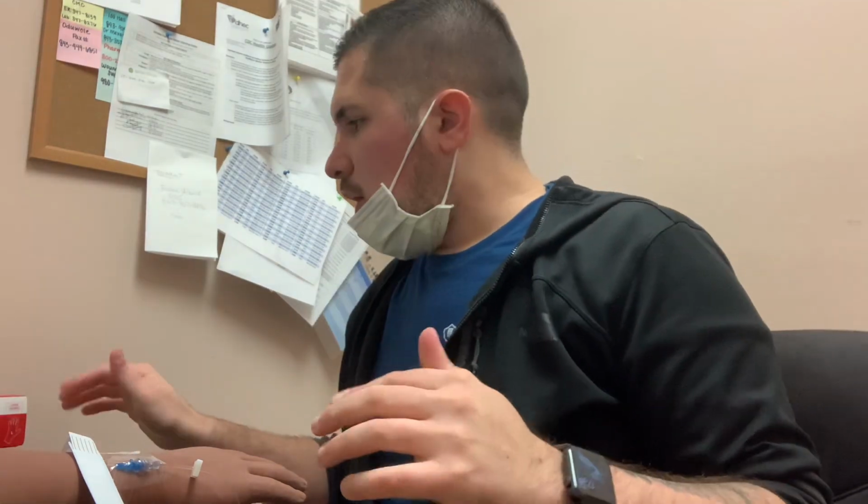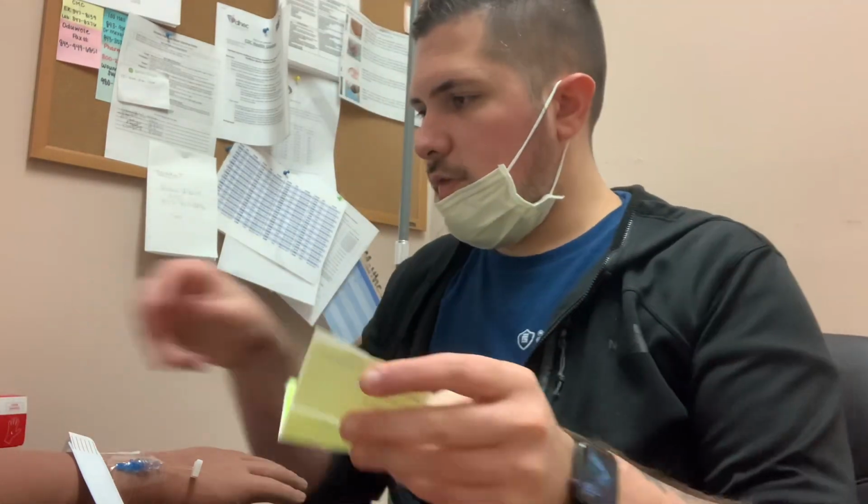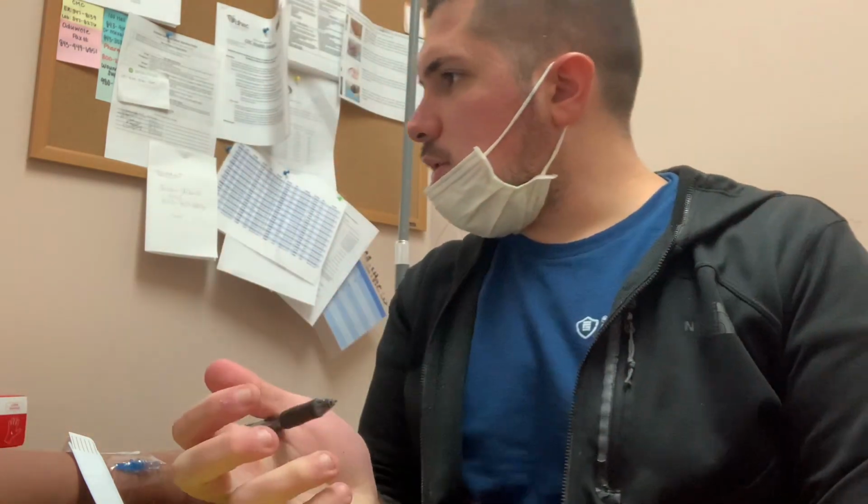Okay, now we are going to fill out the label, which is the date hung, which is 11/12/21. Time hung is 17:15. It's going to go over 4 hours, so 21:15 will be the discard time.